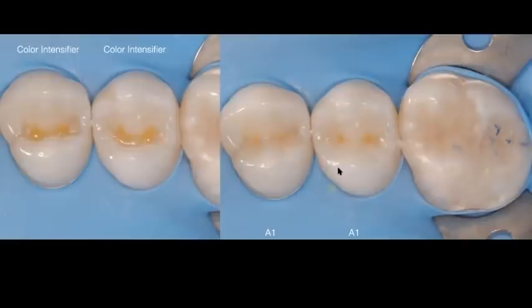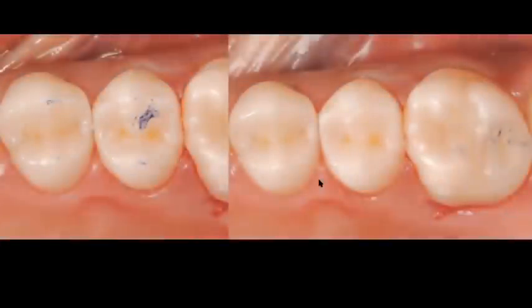And if you look at these restorations, we can just summarize this by saying we have one horizontal layer, one buccal incline, one lingual incline, and a little bit of stain applied in between these inclines in order for me to get this color depth that you can see on these photos. Once I do that, I go ahead and remove the rubber dam. I now adjust the occlusion.